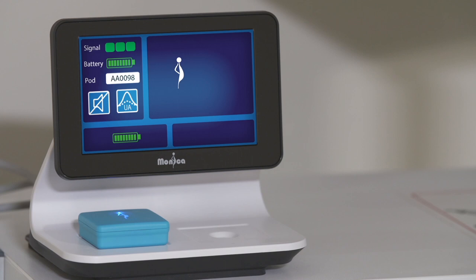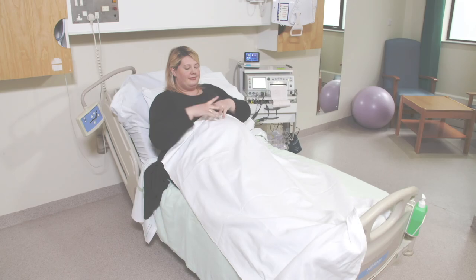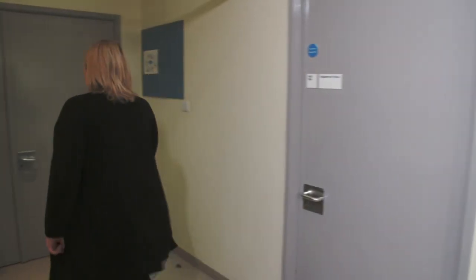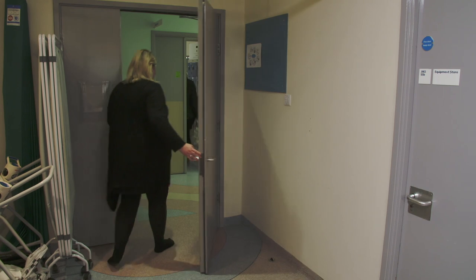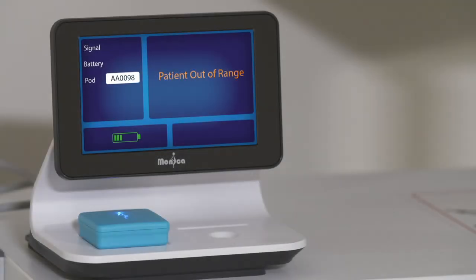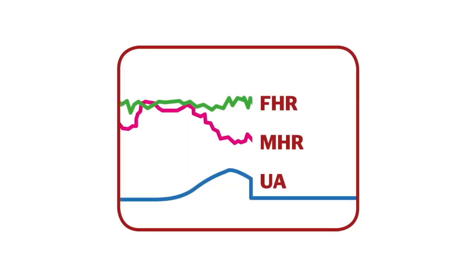Alert message examples include a poor fetal ECG signal — the three green squares will change to one red square and no FHR will be traced, which will be picked up by the fetal monitor as a signal loss alert. For mom out of range: for the mom to move freely in the room and bathroom, you will need three green squares on the Novi display indicating a strong fetal ECG signal. The Novi interface also needs to detect a good Bluetooth signal, and moving outside into the hallway may cause a patient out of range alert. The FHR and MHR trace data will be lost and the UA will flatline; ask the mom to move back into the room if you want to continue tracing. No other action is required.